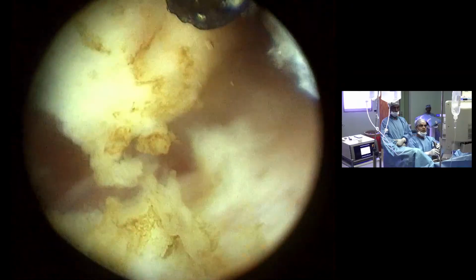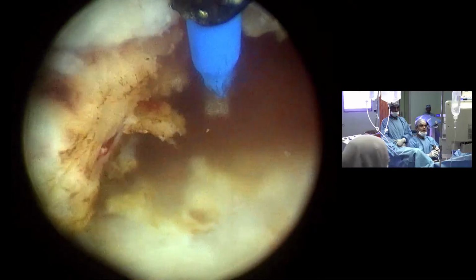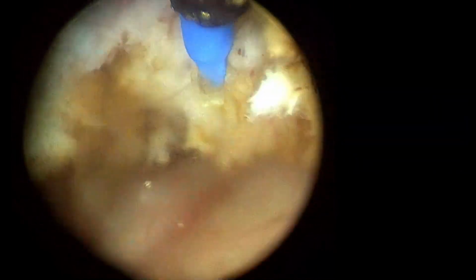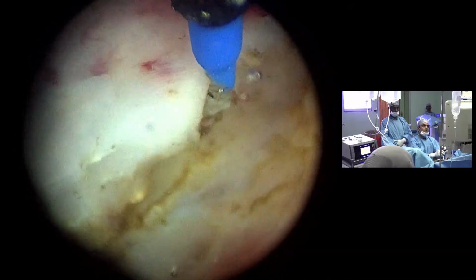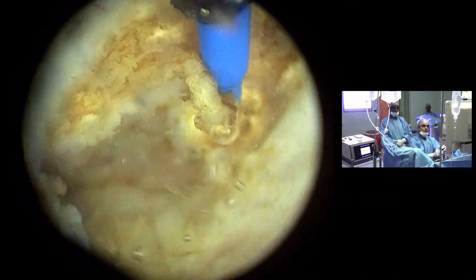Hello. Yes, sir, you are connected. So this is the area of the bladder neck. We are about to finish the right side, and then we'll be proceeding towards the left side. The left lobe is now taking first.